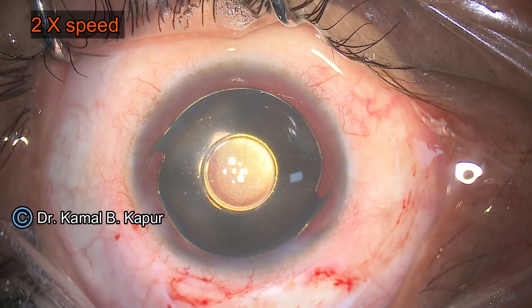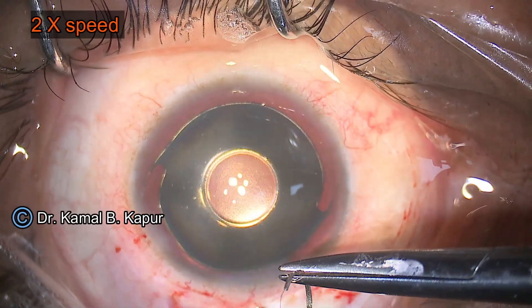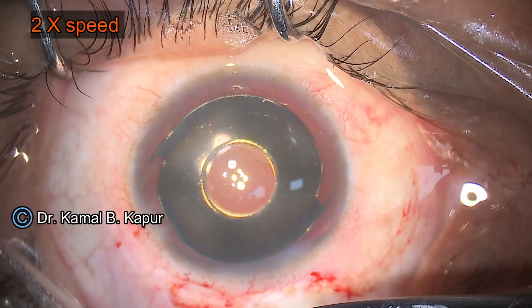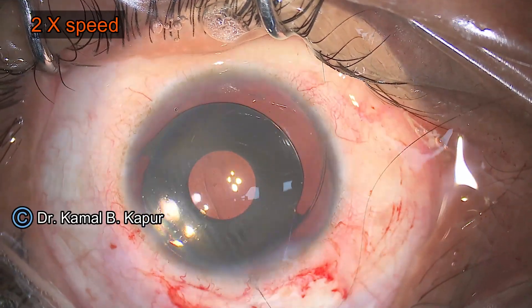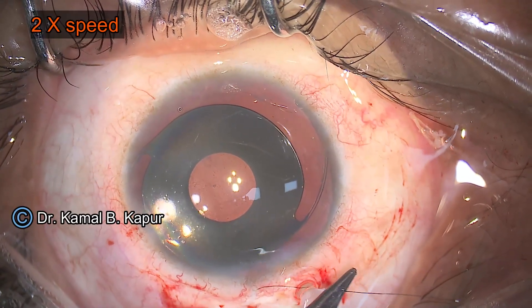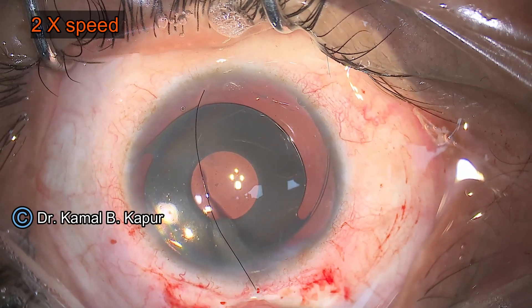Finally the lens is placed in the horizontal position. One more thing to mention: you will see a rim of total aniridia that is not covered by the lens, but in my experience of operating such cases, the peripheral border of uncovered aniridia does not bother these patients much, and they do very well.